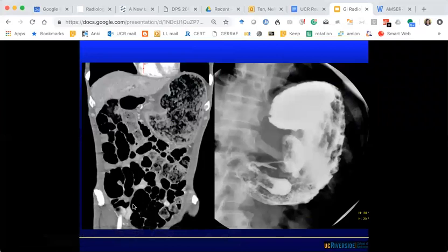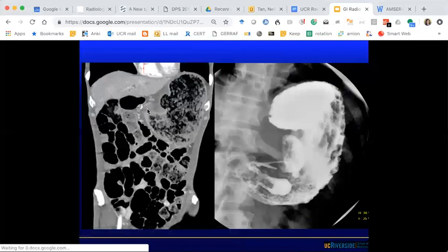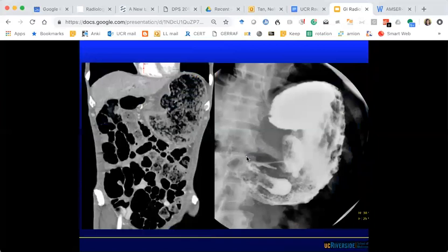The best window to look for free air on CT is lung windows. The air visible in this field of view is intraluminal. If you had an ulcer in the proximal duodenum and it perforated, the free air would be in the retroperitoneal space — very hard to see on radiograph because it wouldn't be subdiaphragmatic as expected with peritoneal perforation. What is this tube here? A feeding tube. Is it in the right place? Yes — it's probably in the third or fourth portion of the duodenum.